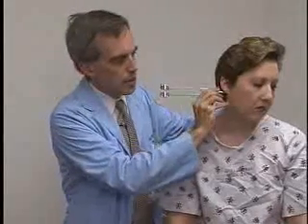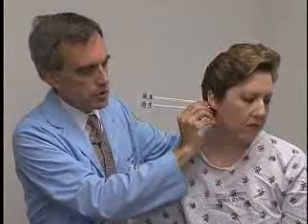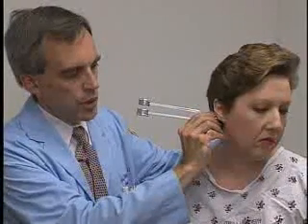The other test is the Rinne test, and this is going to compare air versus bone conduction for hearing. We're going to do a similar test with the vibration by your ear. I'm going to strike the tuning fork and put it on the patient's mastoid — just turn your head a little that way, behind her ear. Tell me when the vibration stops. This is bone conduction. It's still vibrating — I can feel it. And if I put it by your ear, do you hear anything there? Yes, she does. So this shows that air conduction of this sound is better than bone conduction, which is normal.